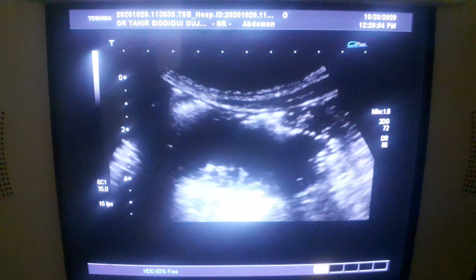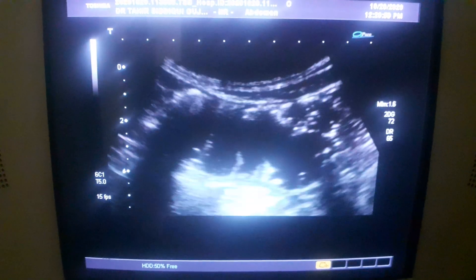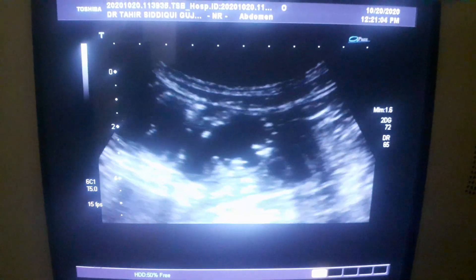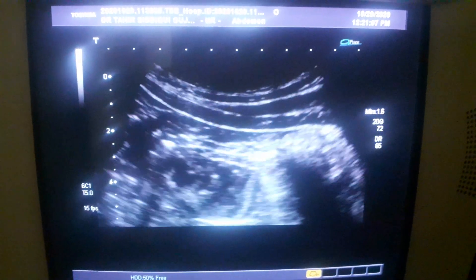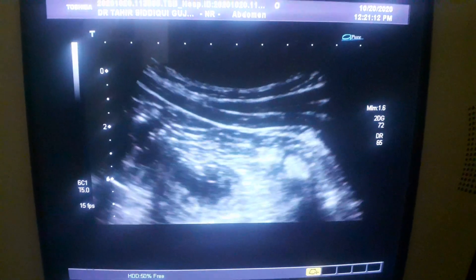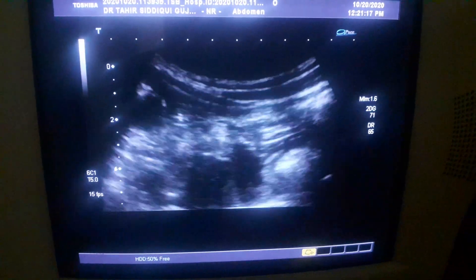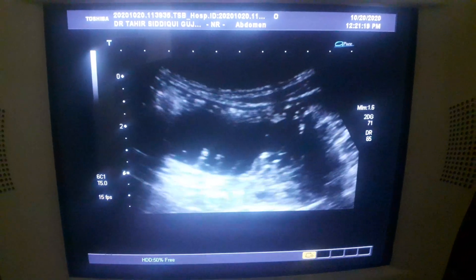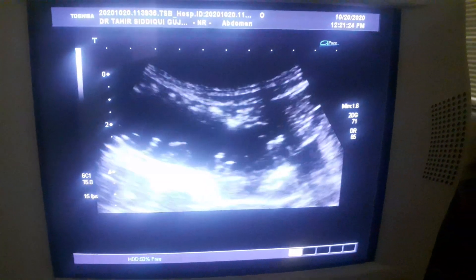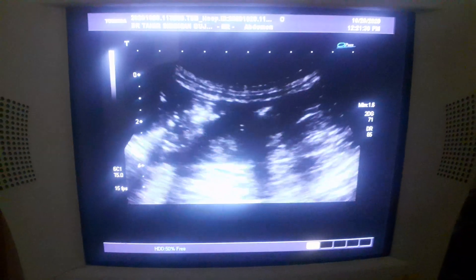You will see the movement of the food material. Now, as I move the probe from the right hypochondrium down longitudinally, you can see the dilation of the bowel segments all along the left side.